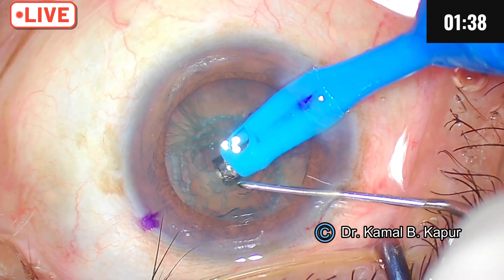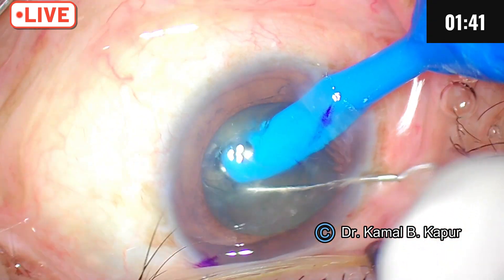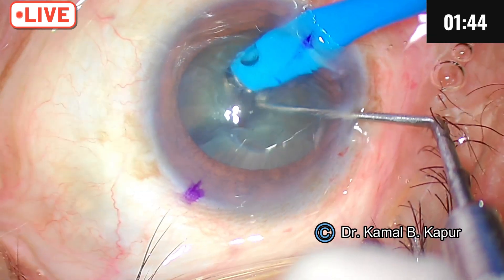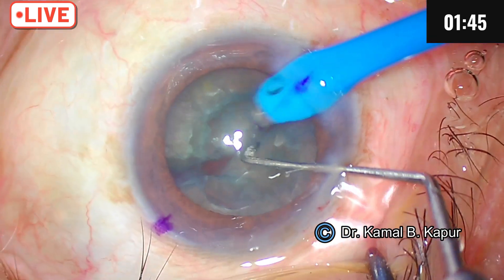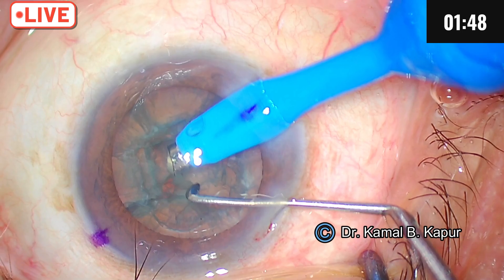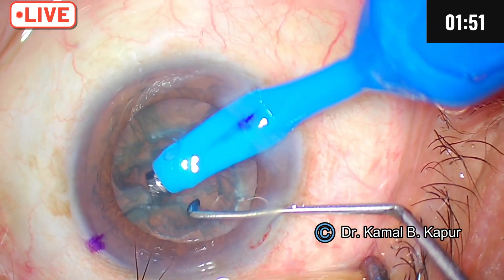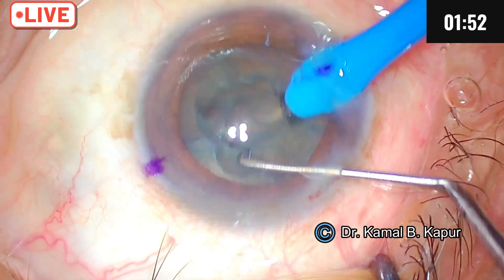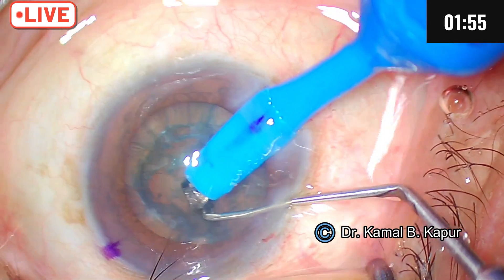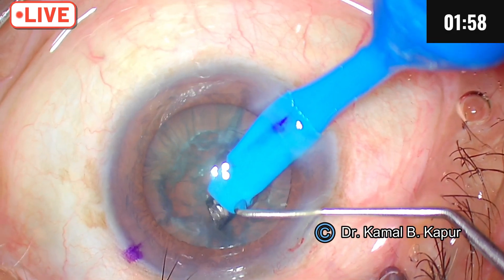Five phaco power. You can see it is a very soft cataract but we managed to chop it. I am using phaco power five and still managing.